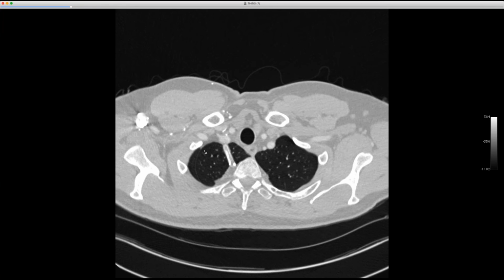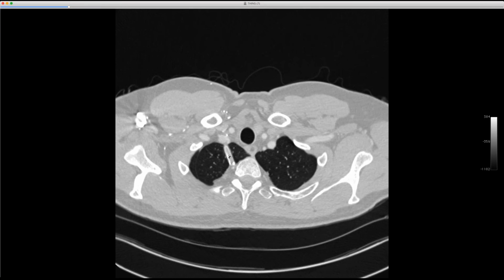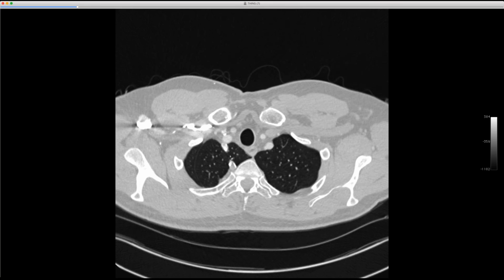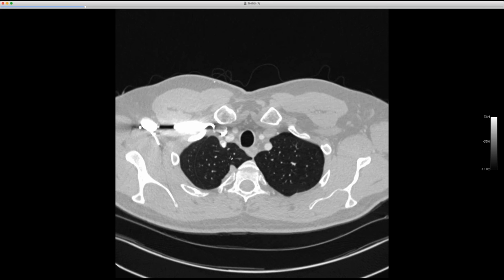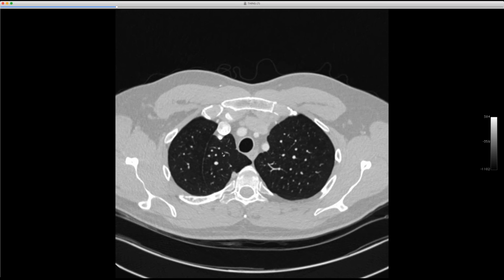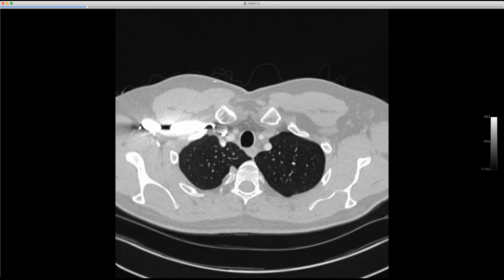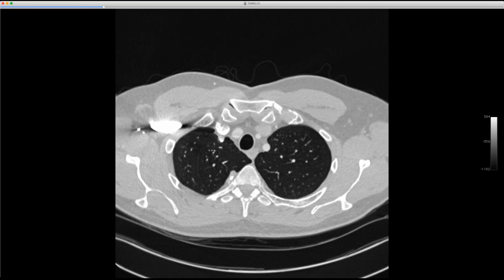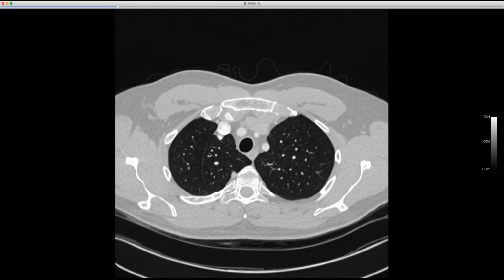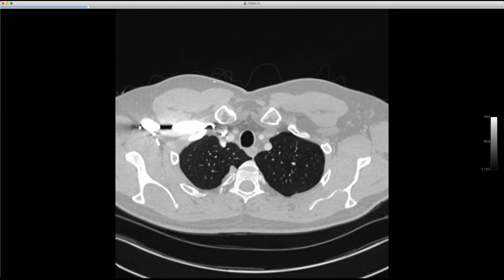If I can show one really quick too. But it is possible that this actually popped out of this fissure at some point, and it took the mesoazygous with it. Yeah, that's not a bad idea. And the lung is just folded around it. Right. So I think the difference is mine has the pneumothorax, but I bet it's the same mechanism, because it would make more sense. The reason the azygous fissure even forms is the vein transits, pushes, invaginates into the lung during development.